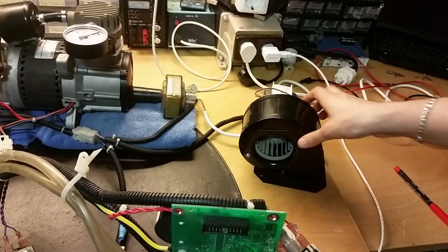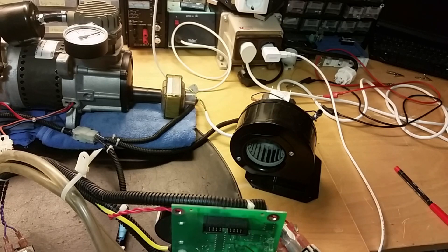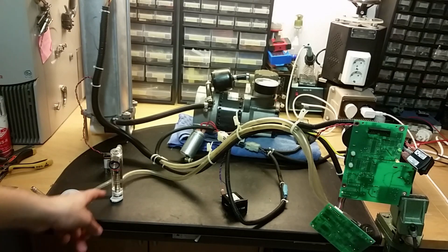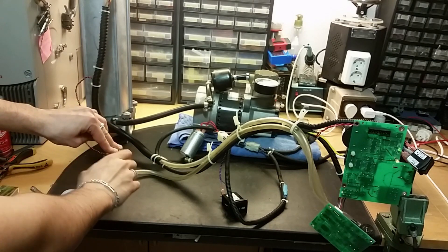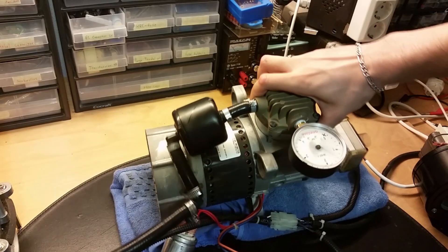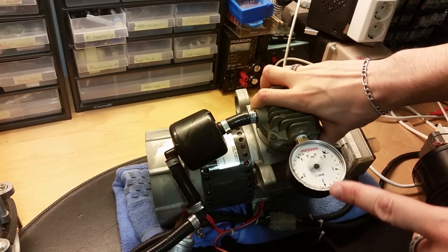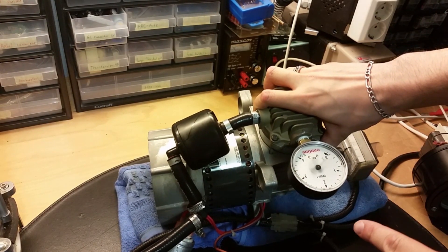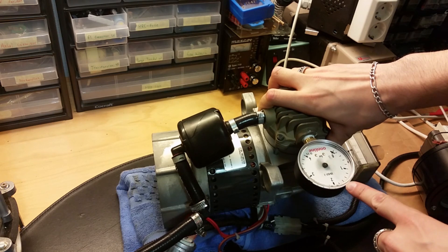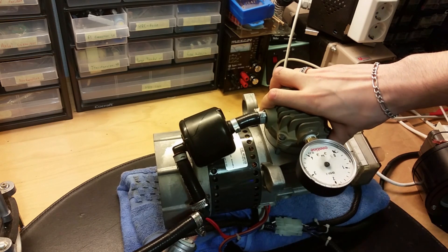And on the output there's another filter used for stopping bacteria and viruses, and of course there's the squirrel cage fan. Let's turn it on and see what happens. I adjust the flow to about 2 liters per minute. The compressor is very shaky — look at that gauge, it's jumping back and forward. It's on about 2 bars, a little bit more actually, jumping very violently.